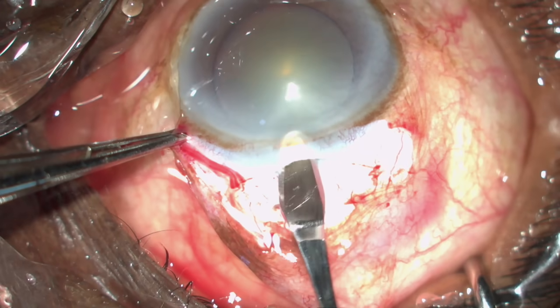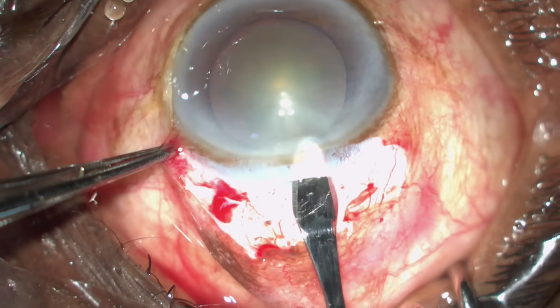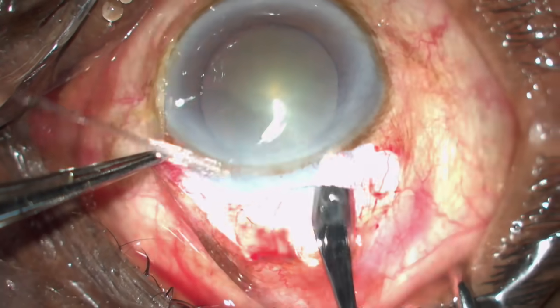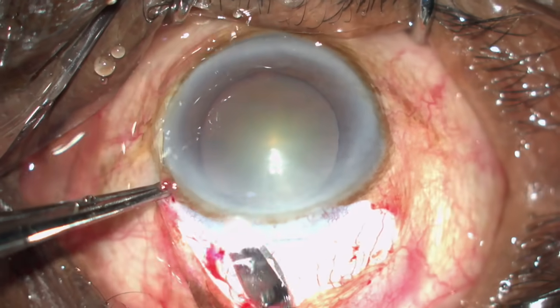When you are near the cornea, lift it up a little so that you don't make a premature entry. Point it towards six o'clock and start making the tunnel so that the cornea, the sclera, and the incision which you made are all cut evenly together.